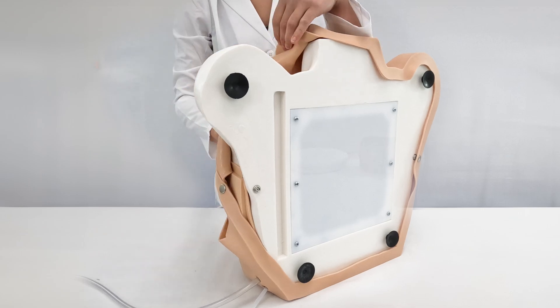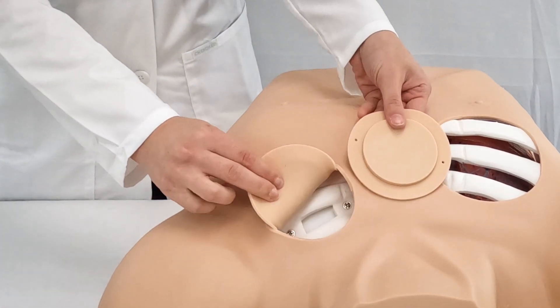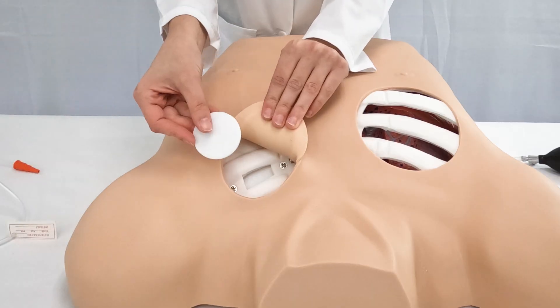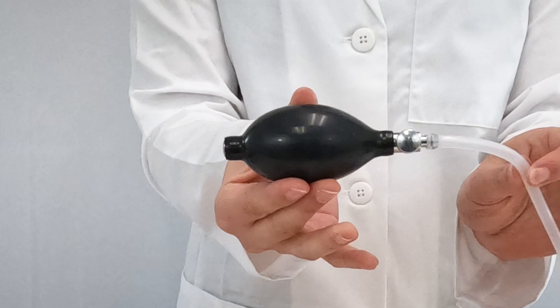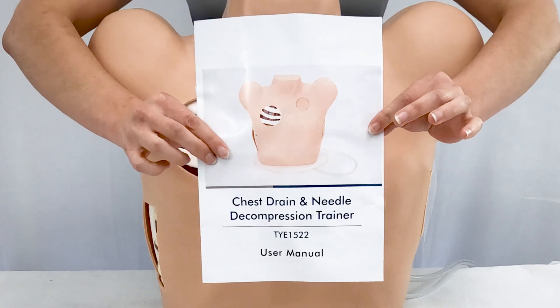This trainer comes with replaceable skin, two spare upper chest pads, two spare outside left chest pads, five chest seals, an inflation bulb, a fluid reservoir, and an operation manual.